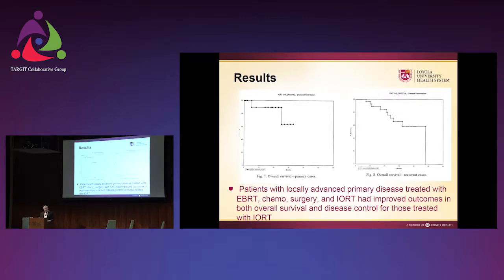So there is a lot of data out there, and biologically it makes a lot of sense. And the IntraBeam device, we've done 2 or 3 cases in the same day by rolling it between ORs. So it gives you some flexibility. And we used to send patients a lot up to Mayo because they have a nice intraoperative operating room, but our surgeons won't send anybody anywhere anymore in this day and age.